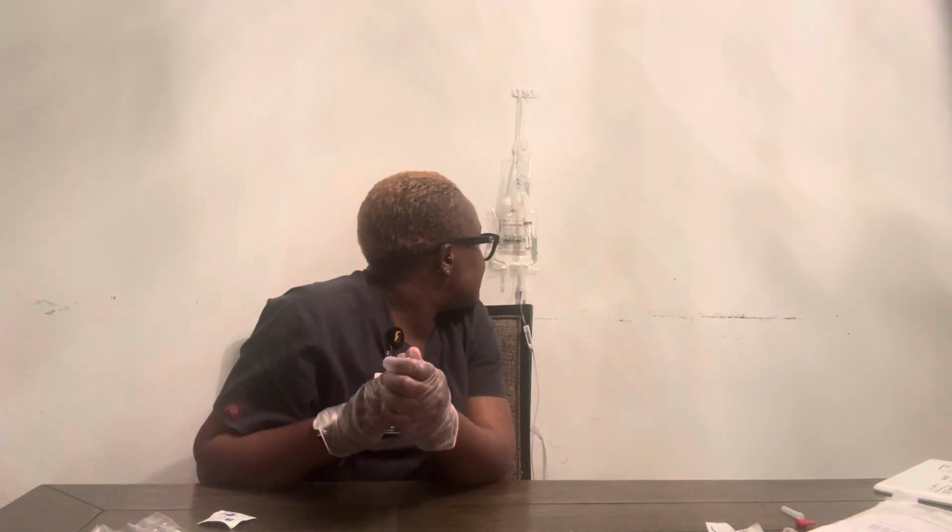I have to make sure there's no redness and no swelling, and the patient is not having any pain at the IV site. And since amoxicillin is a high risk allergy medication, I want to ensure that the patient is not experiencing any hypersensitive reaction. If the patient is experiencing any reaction, then I would pause the infusion.